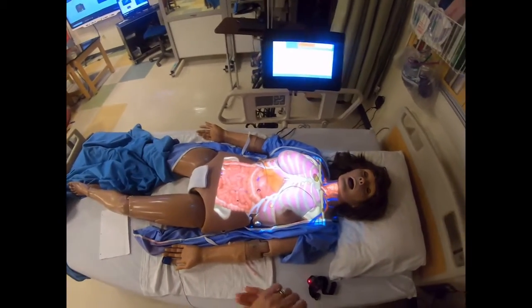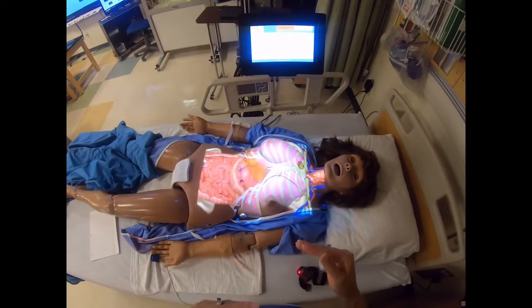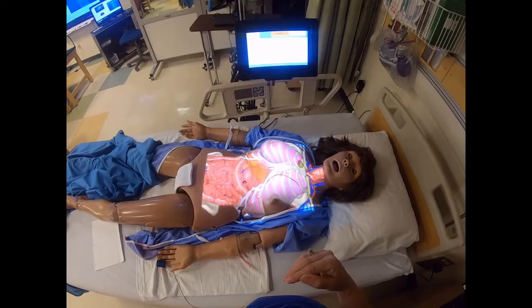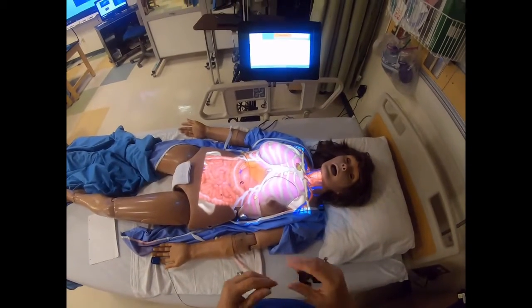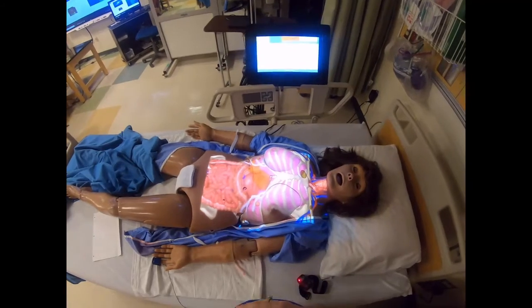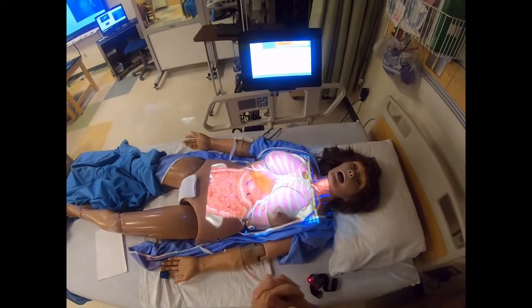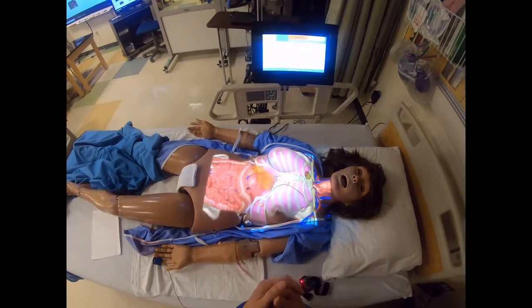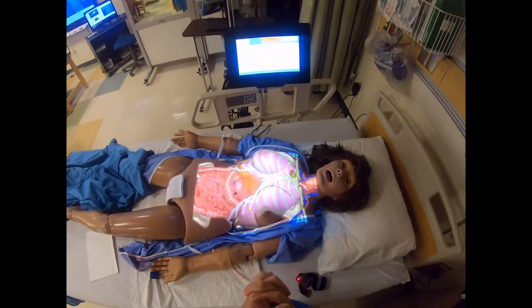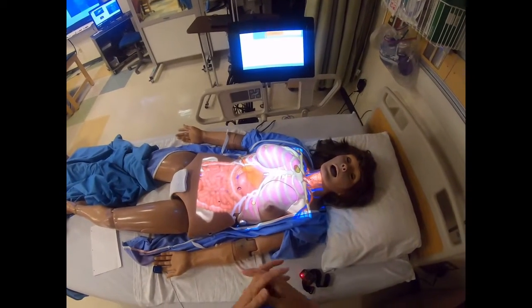Normal pulse oximetry is anywhere from 90 to 100%. We actually like to see the ideal of being 94 to 99%. Anything less than 90% is cause for concern when it comes to patient care. Usually disease processes affect our patient's ability to oxygenate well. We don't like seeing a pulse oximetry of 100%.